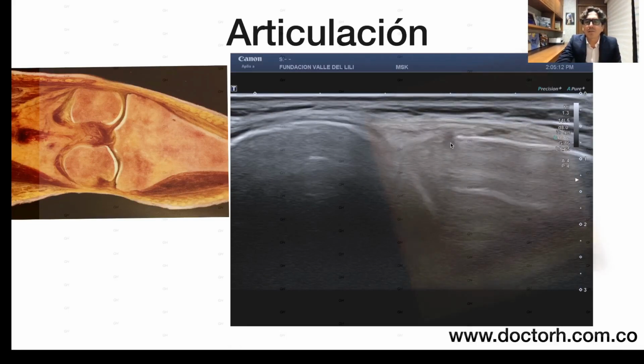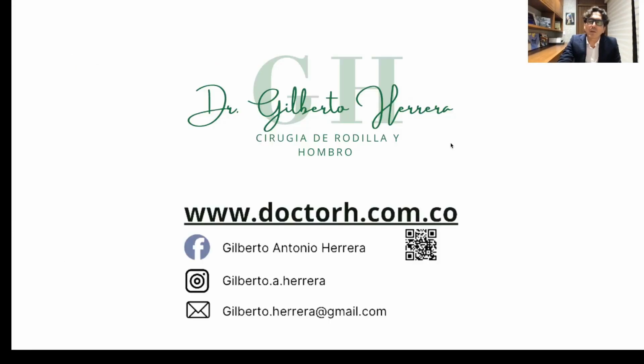So, the identification of the structures in the joint are anatomical, which allows us to identify joints.